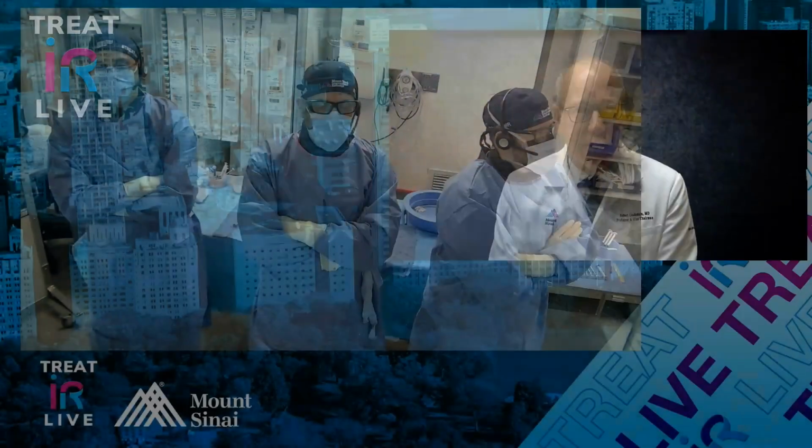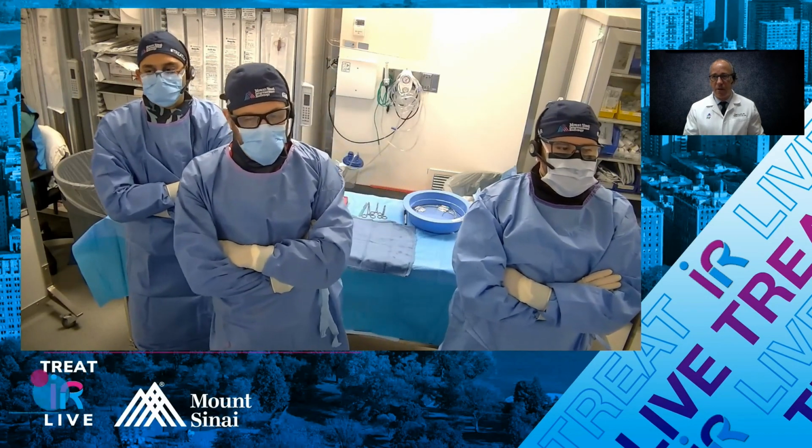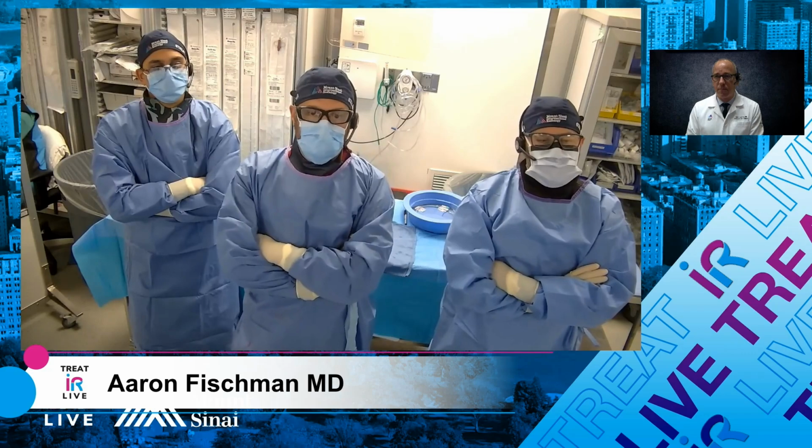I'm going to hand it off to my partner, colleague, and friend, Aaron Fischman, who's in the lab right now. He's in room one. All right. Well, welcome to Mount Sinai. Welcome to room one. It's really an incredible honor and privilege to be able to present this case.